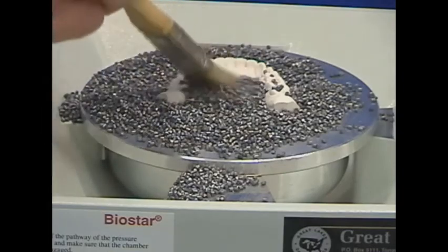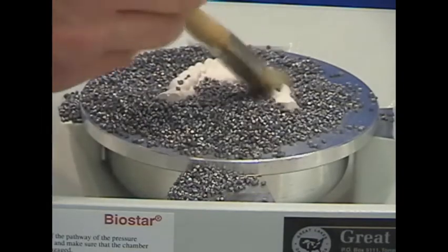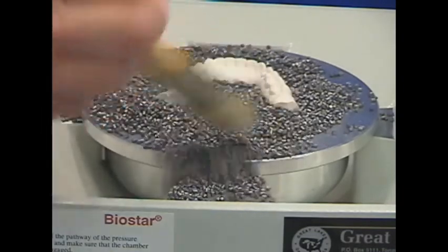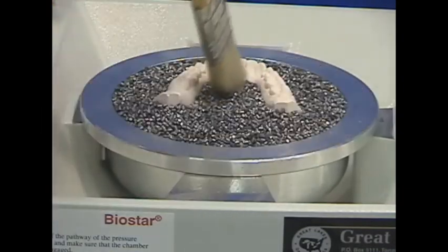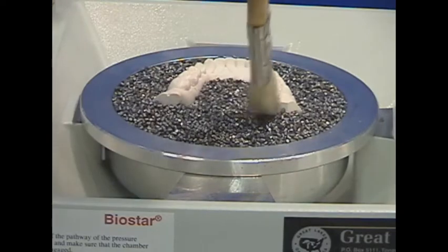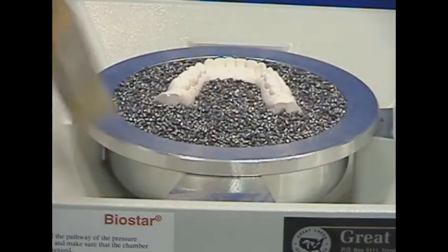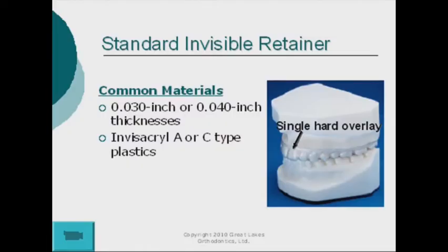Sweep excess pellets from the model. Pellets should contact the model 3 mm below gingival margins and extend to the rim of the pellet cup. The most common invisible retainer material is the Invisicryl A or C type of 0.030 or 0.040 inch thicknesses.